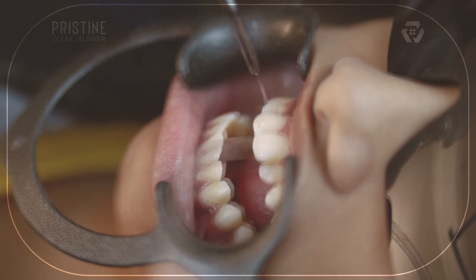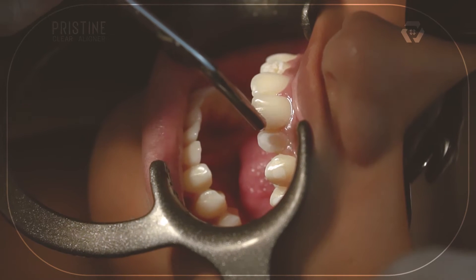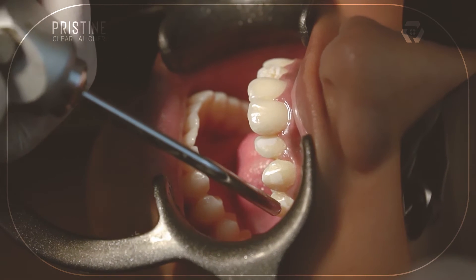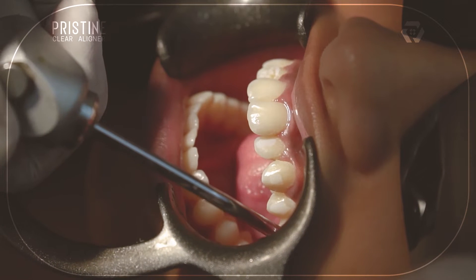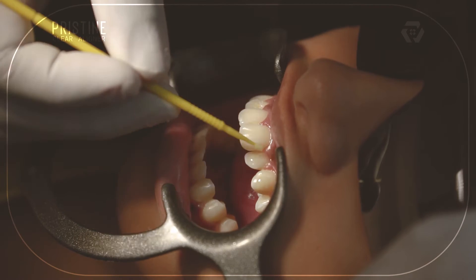Wait for 30 seconds, then wash and dry the spot. Look for a frost-white appearance. If you cannot find a frost-white appearance on any of the etched area, repeat the procedure on that particular area. Then apply bonding agent and cure it.